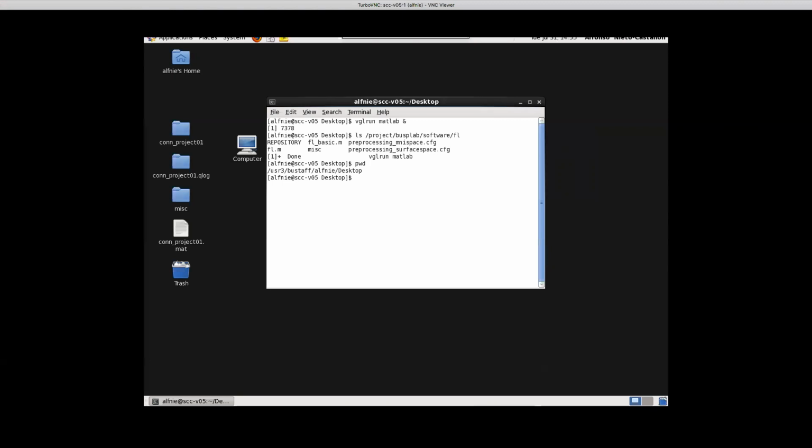Is there some argument, if we're doing individual speech lab ROIs and we translate everything into FS average space, that for each individual you need to make sure you also have the individualized speech lab ROIs translated into FS average space? No, FS average and subject space are exactly the same. I mean, you're missing some. I'm not explaining something clearly enough. There's only a 2D interpolation difference. So imagine your subject-specific surface that looks at the actual ribbon, or the difference between the white matter and the gray matter for that individual subject.